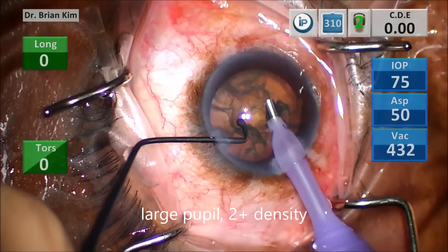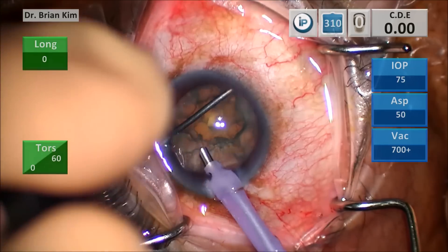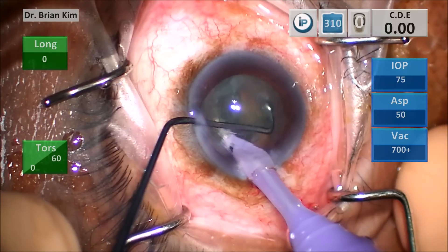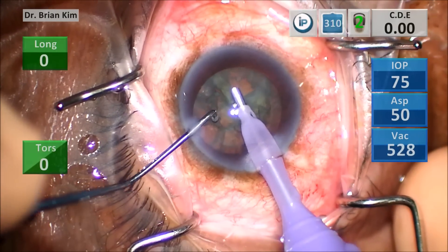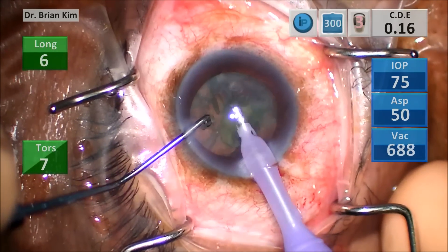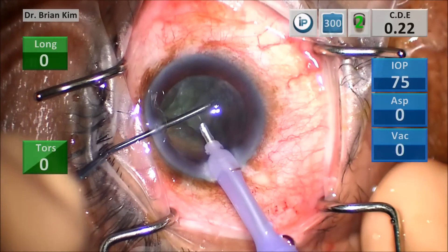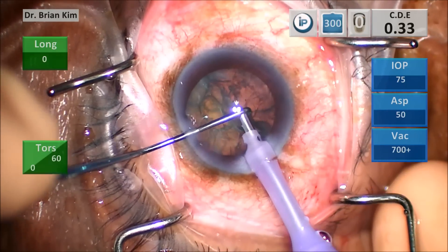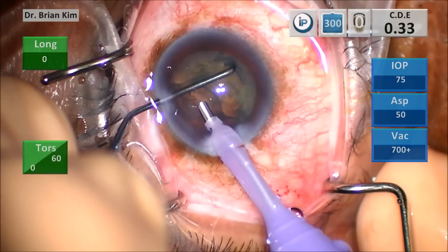This is a large pupil, 2 plus density. You see how I point the tip outward, slide underneath, and then rotate my wrist so that the tip is pointing towards me. Now the two pieces are held and fractured — same thing on this maneuver. I have three pieces now. This quadrant is mobile so I'm going after it with the Faco tip, and this is safe because it's mobile. Because this is awkward to approach with the Faco tip, I'm using the chopper to grab it at the equator and sliding it centrally. A big mistake that learning surgeons and residents do is going after pieces with the Faco tip, which is very dangerous and not advised.